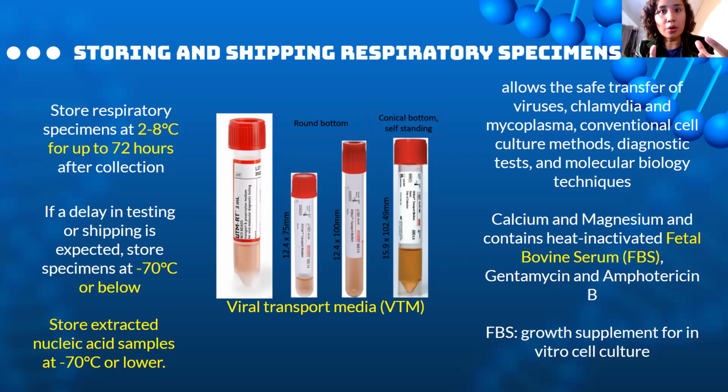So how do they collect this serum? By getting fetal blood from pregnant cows. Yan. So itong FBS, it's a growth supplement for the cell culture. So talagang they harvest the blood of cow fetuses. Tapos, they get the serum. Alam niyo naman siguro how serum is acquired. Hindi ba, ipapaklat mo yung blood tapos you will centrifuge it tapos maghihiwalay yung cell component saka yung serum. So, yon guys, pregnant cows.